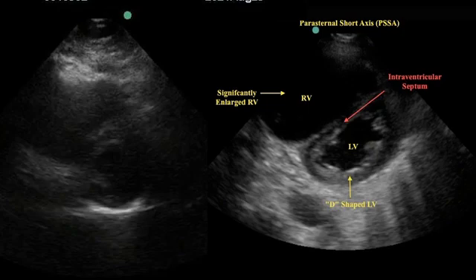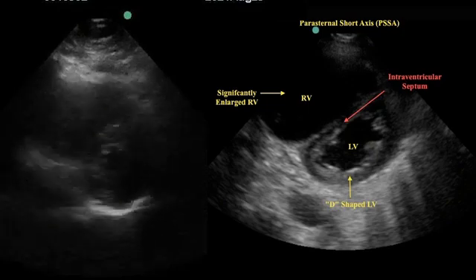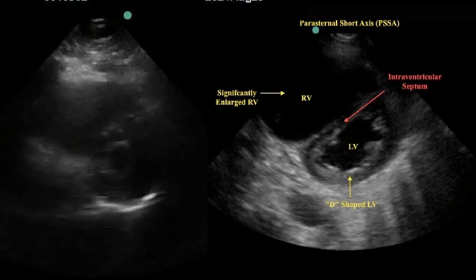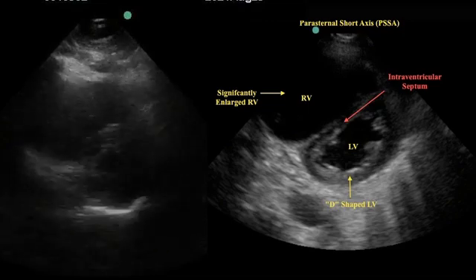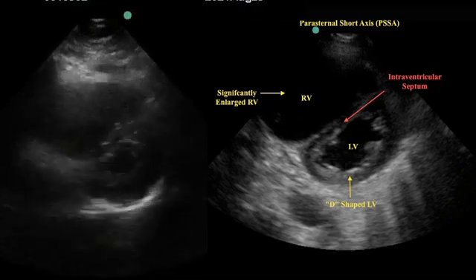You can also see this RV enlargement in the parasternal short axis view. When the RV is under pressure, it stretches and then pushes the LV to give you this D-shaped ventricle in the parasternal short.